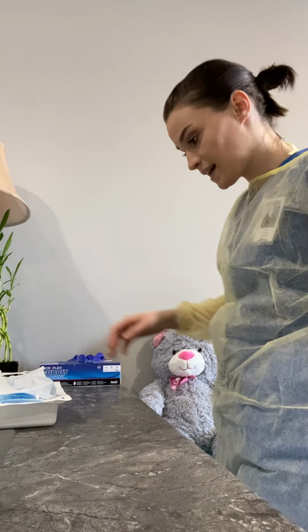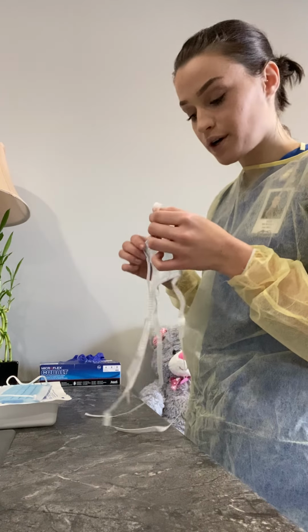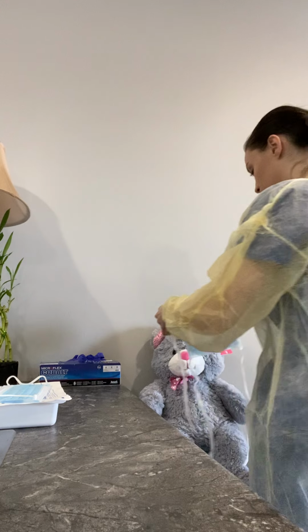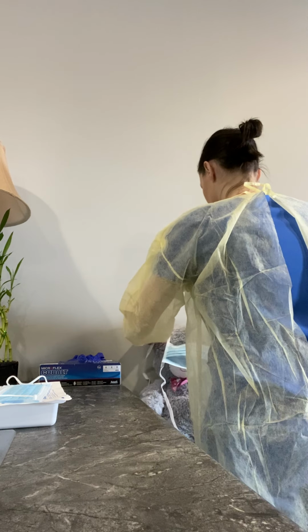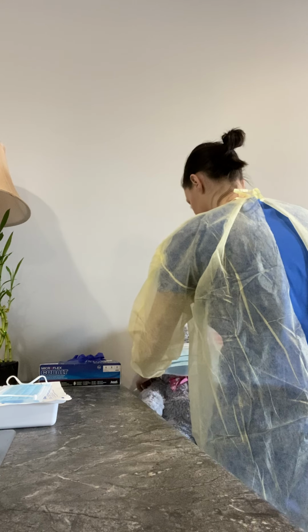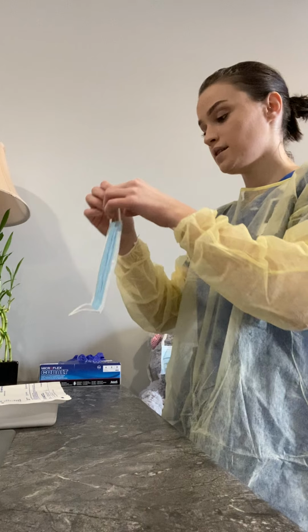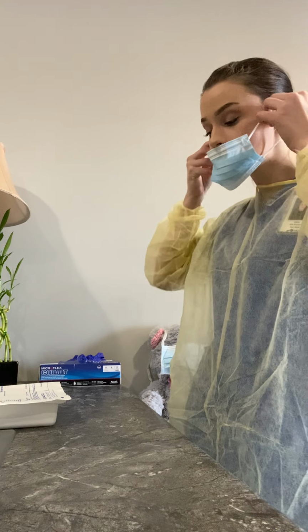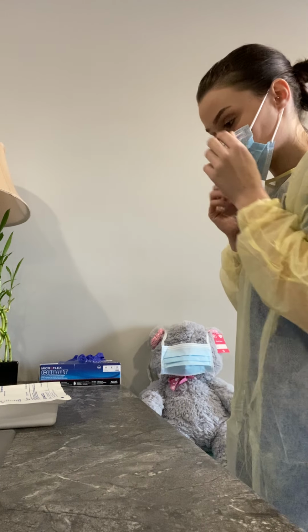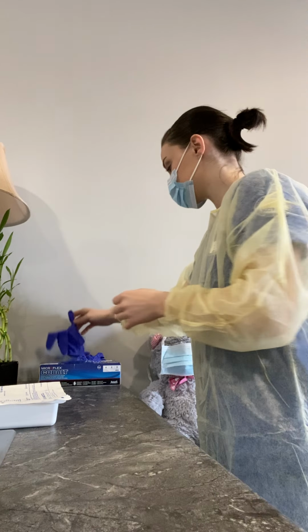Okay, so I've got my gown on. I'm going to ask my patient if she can put her little mask on. I'm going to let her know that she needs to turn her head away while I change this dressing. I'm going to put my mask on. All right, so we've got that. I'm going to put on clean gloves.